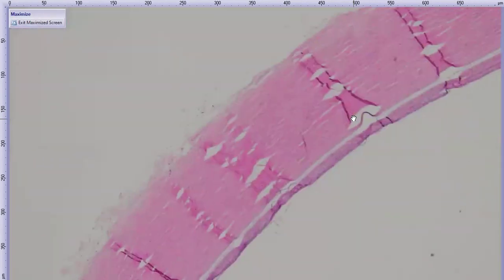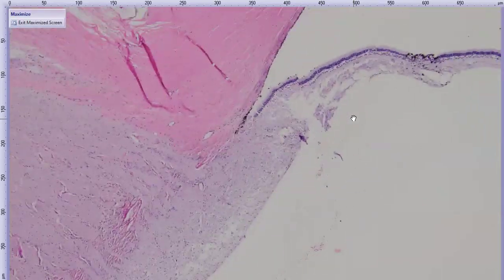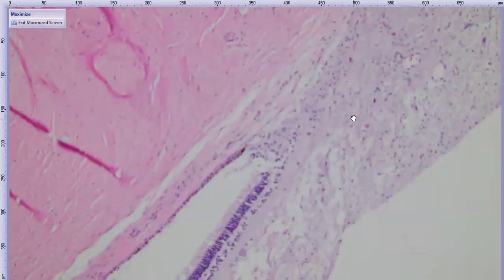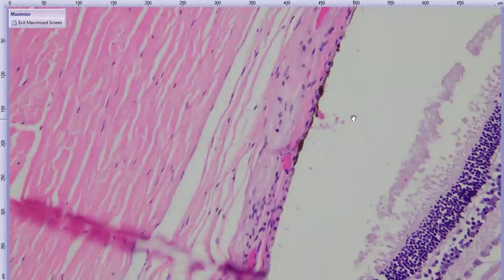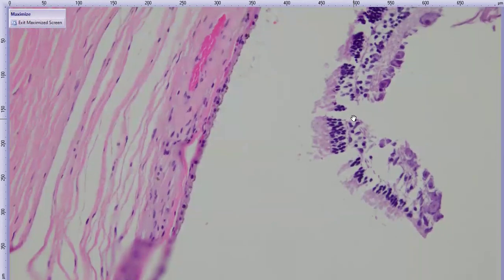And then as I'm looking at this fundus, another thing that was a little unusual, let's head back, making everybody slightly nauseated here, hang on. Let's head back to the optic nerve, there it is. It was a long way away, as it would be in a horse. So this is the ventral side of the eye. And we can see that the RPE cells are pigmented. If we walk across to the dorsal side, the RPE cells are still pigmented, which is kind of unusual because this was supposed to be a dorsal-ventral cut. It's a little bit of a lighter pigmentation on this side.